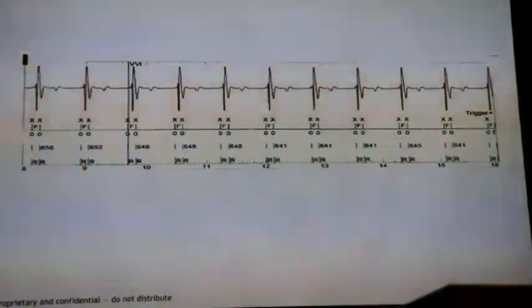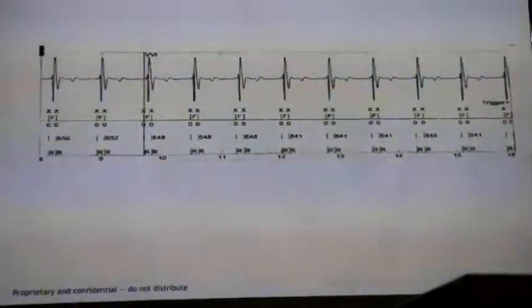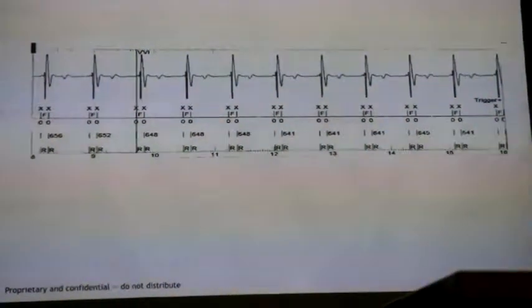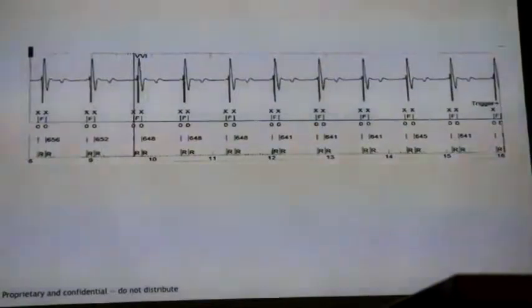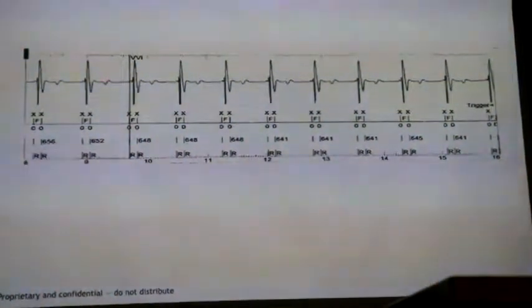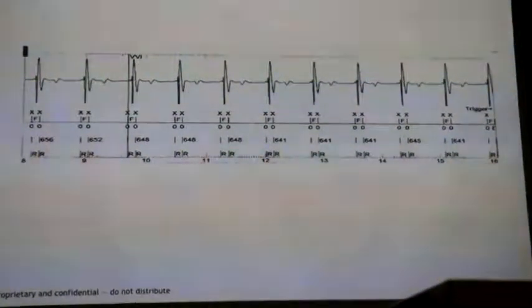Usually when you have a problem with sensitivity, it's usually a small R wave, especially T-wave oversensing. T-wave oversensing pretty much is always tiny little R waves. You have to move your lead somewhere. So at implant, that's why we're asking for signals greater than kind of 5, 6-ish.